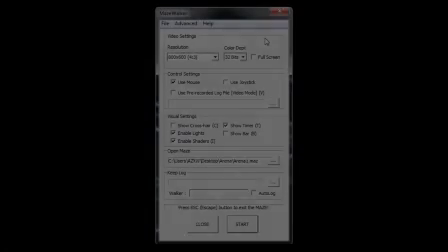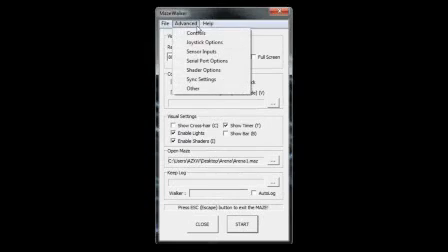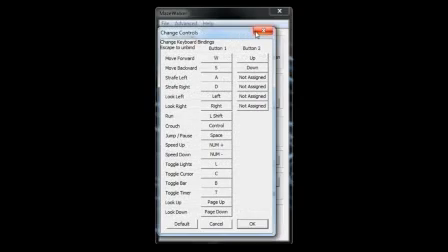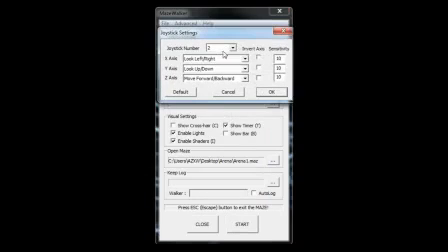Individual trials of the experiment are run through the use of the Maze Walker program. Changing settings in Maze Walker allows users to further specify the conditions of the experiment. The control scheme can be changed to accept input from different devices, including keyboard, mouse, and joystick.